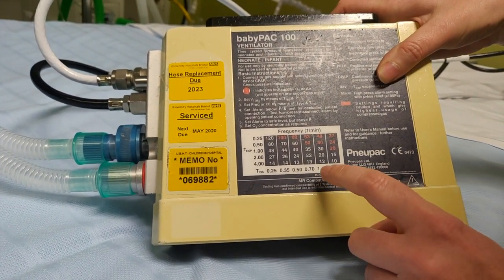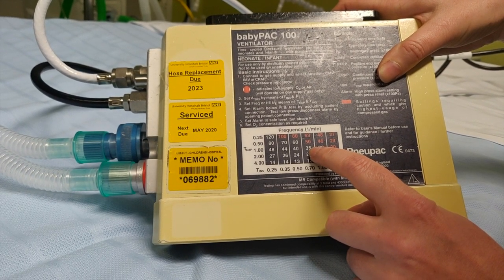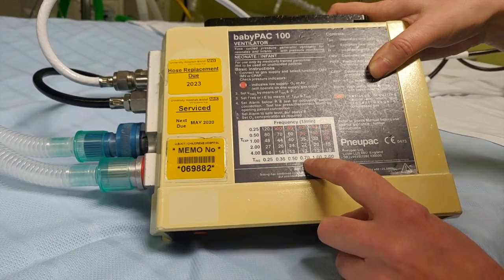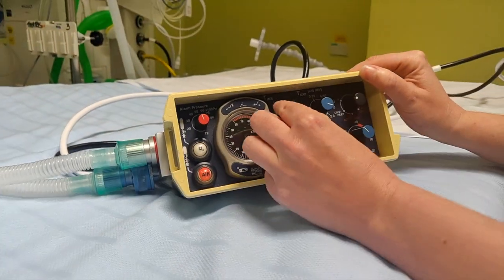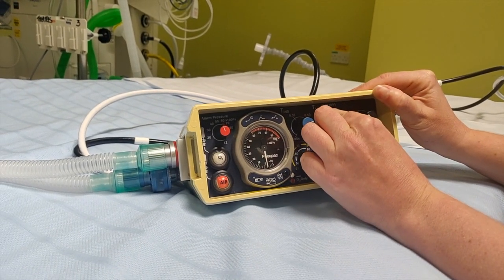So if we want to set up the patient — let's imagine this is a small baby — we want a rate of 35. We can put an expiratory time of 1 and an inspiratory time of 0.7. So let's set that up: 0.7 and 1.